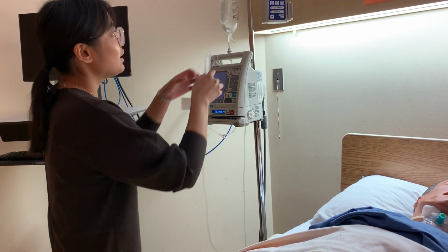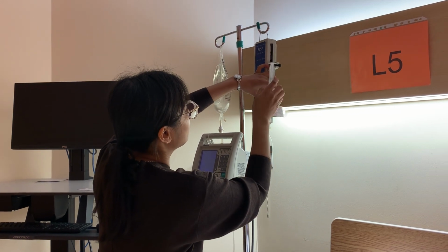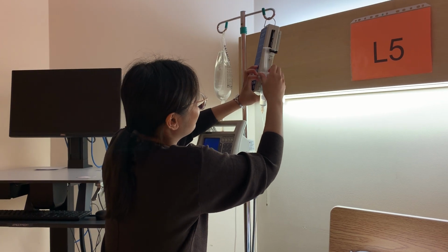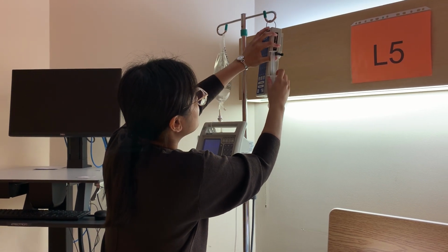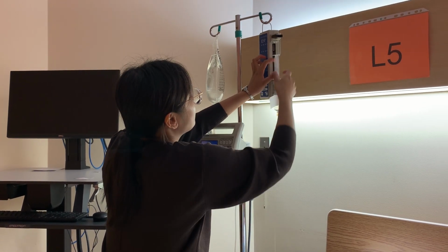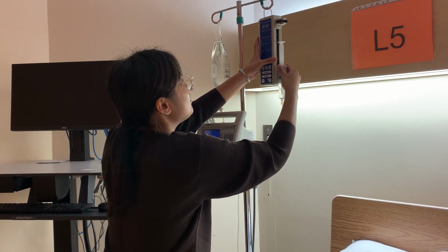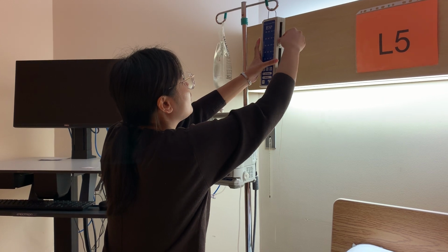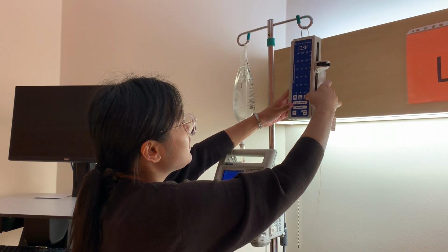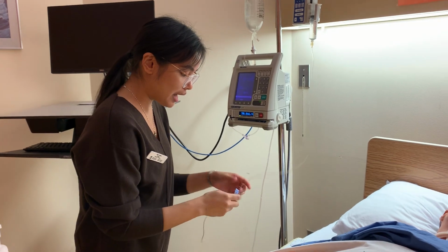Okay, I'm going to set it up with my CIVA pump. I'm going to slide her. And I'm ensuring that it's at the 60 minutes as indicated. So it's leveled with the plunger and it's at the right time. I'm going to press start and wait for the green to let us know that it's actually infusing. There's no kinks. Everything is unclamped, so I'm unclamping that.